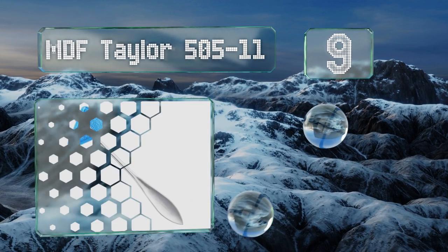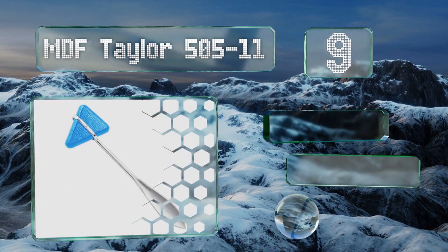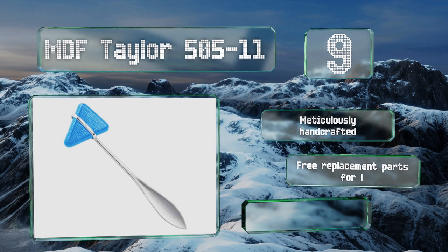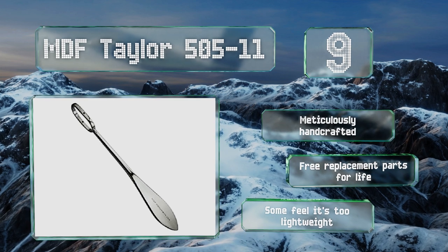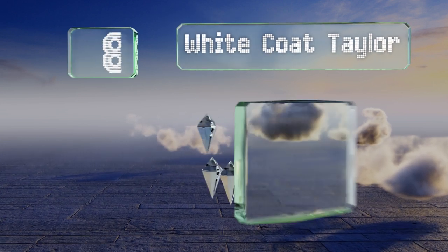At number nine, the MDF Taylor 505-11 isn't fancy but it is reliable. It utilizes a pin system to hold the triangular head firmly within the encircling band, essentially eliminating the chance of it ever falling out during an exam, which looks very unprofessional. It's meticulously handcrafted and backed by free replacement parts for life, but some feel it's too lightweight.